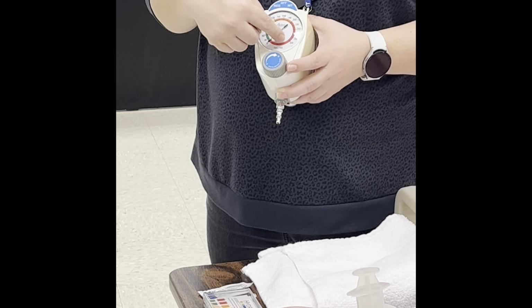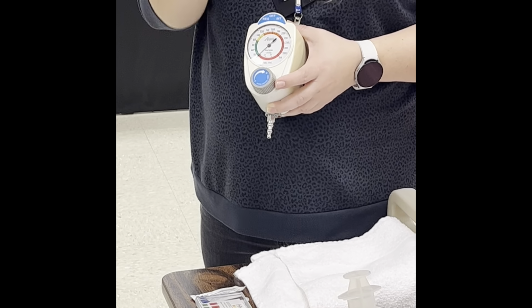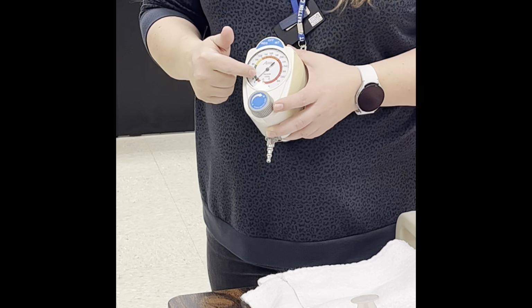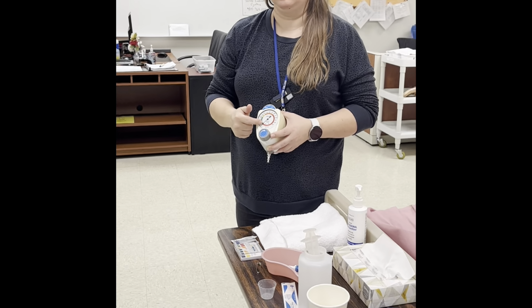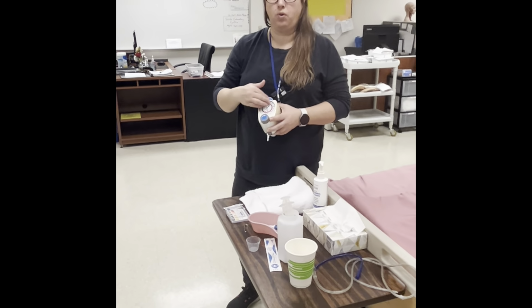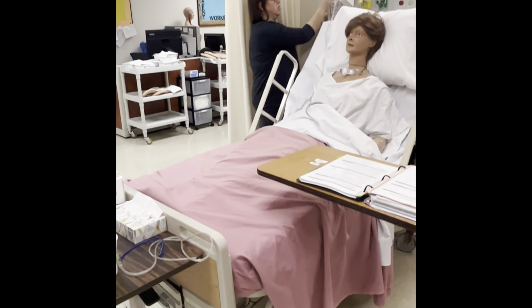I had a resident once tell me that they wanted it on high suction continuously, and I said, no, sir, that's not happening. We always do it in the green, and that's why the green is there. So even those other settings, if you've ever used a vacuum before, it's too high, that's why. So this vacuum should always be in the wall.